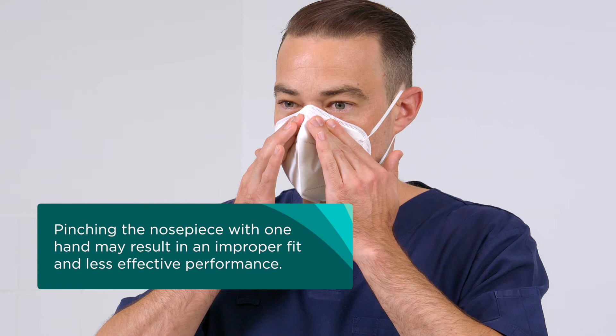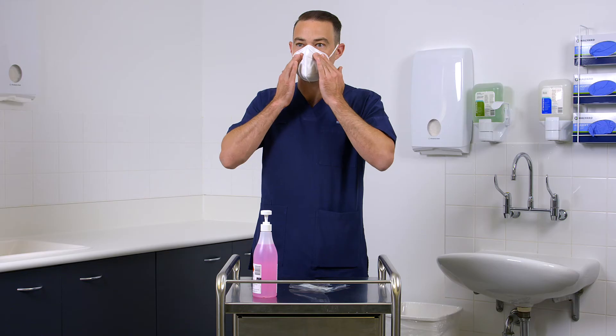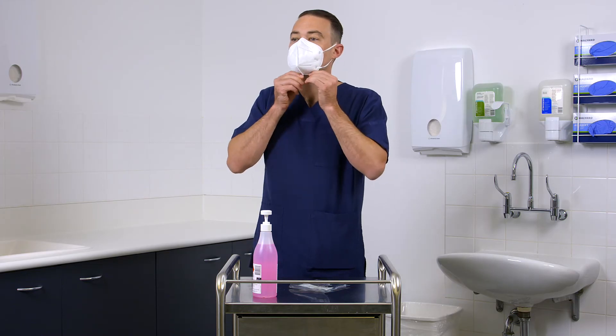Using both hands, mould the nose clip to the shape of your nose bridge by pushing inwards. Always use two hands when moulding the nose piece. Pinching with one hand may result in improper fit and less effective respirator performance. Make sure that hair, facial hair and jewellery are not between your face and the respirator as they will interfere with the fit.